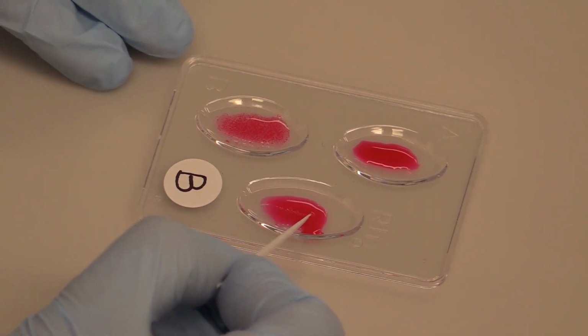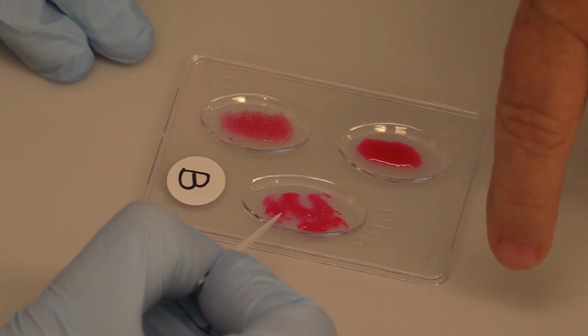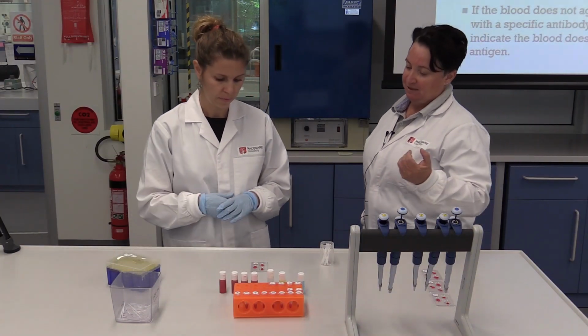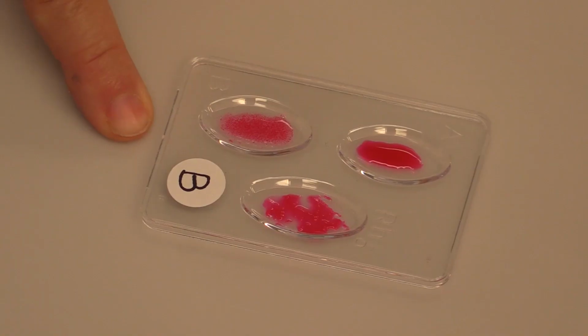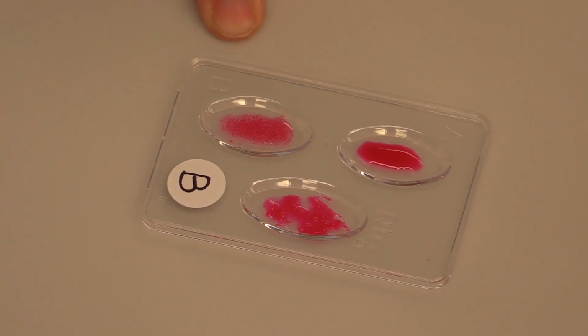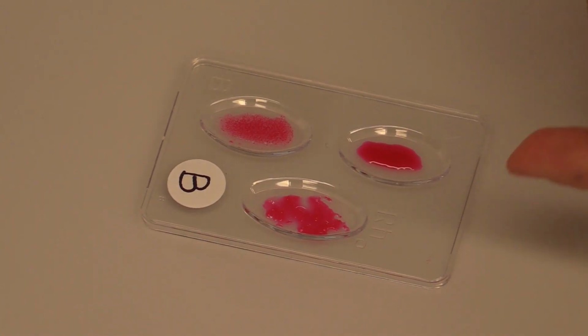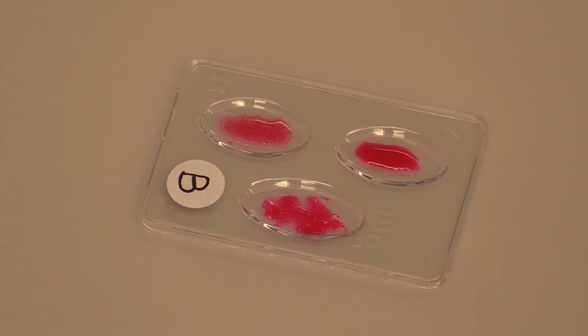So on the diagnostic plate, we have A, B, and then RH plus or minus here. What we would expect for this sample is, because we know that the positive control is B, we would expect to see clumps in B, so the agglutination there, and then we would not expect to see agglutination in A, the liquid staying in suspension. And then we can see that there's agglutination in the RH factor, and so that's B positive.